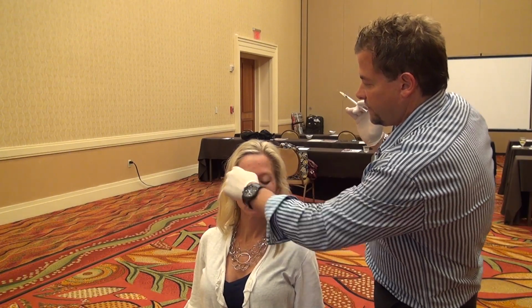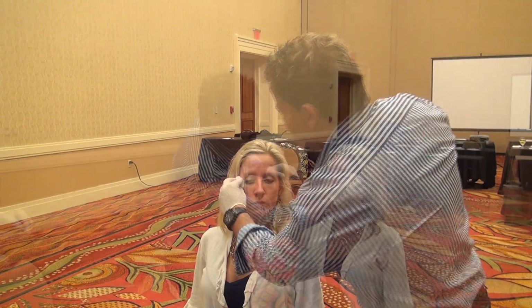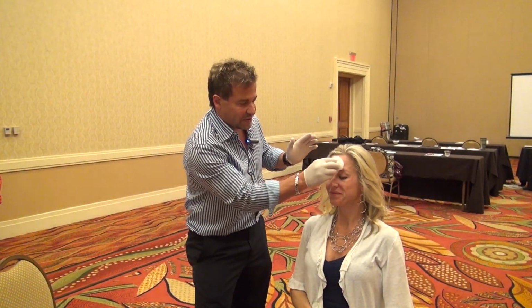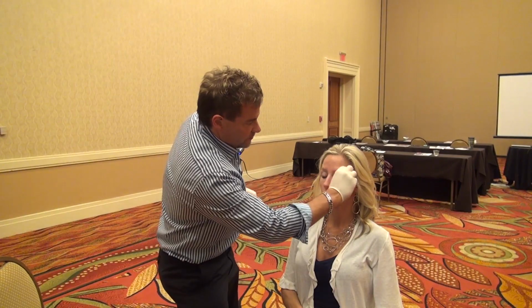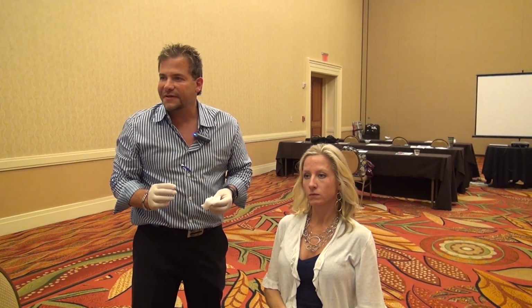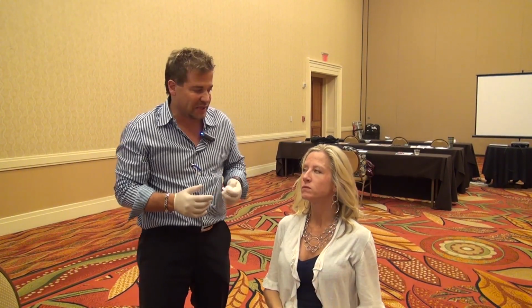Okay, and then you want to get the forehead, just like we did the frontalis, and then we did on the side. The other thing here is don't let your patient have blood drip down or anything like that. Always constantly dab it like this so that nothing like that is happening. Okay, good. For the reaction area to go down, it depends on the person. Everybody's a little different. Some people you may not even see anything.